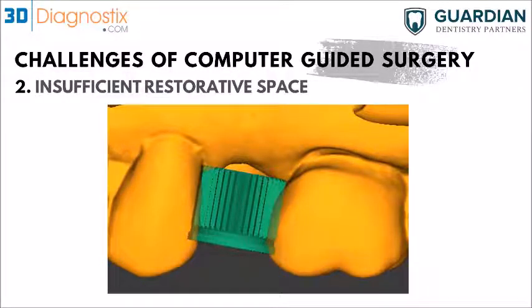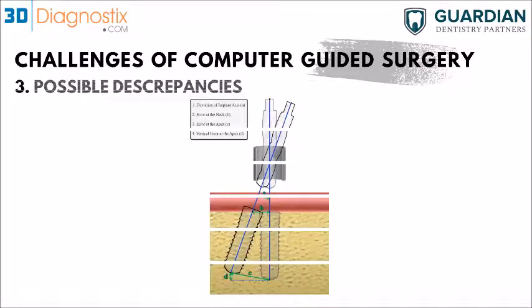We have such a concern, and then possible discrepancy. We need to understand the anticipated discrepancy that might happen with a guided approach. That depends on a lot of factors: the length of the implant, the length of the drills you're going to be using, the height and length of the sleeve, and the difference between the position of the sleeve and the bed of the osteotomy. If you use long components or long drills, usually you'd have some discrepancies, basically at the apical third.